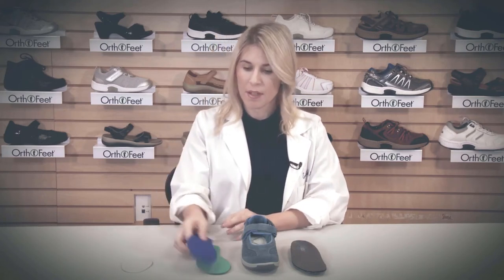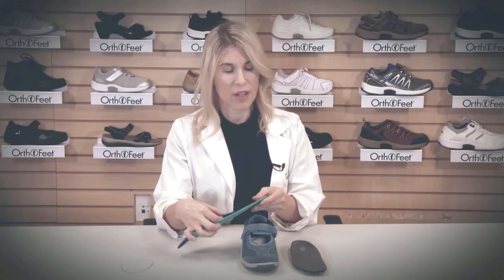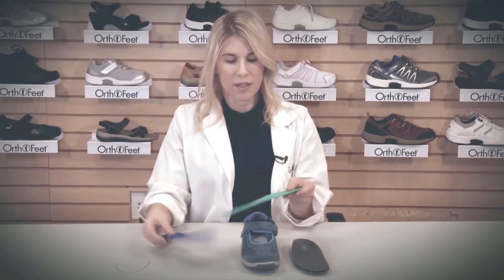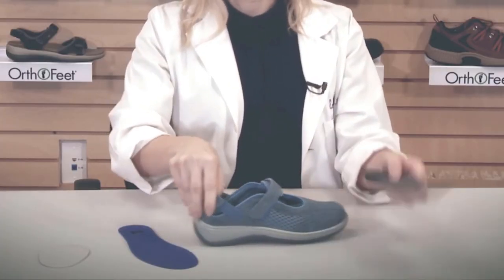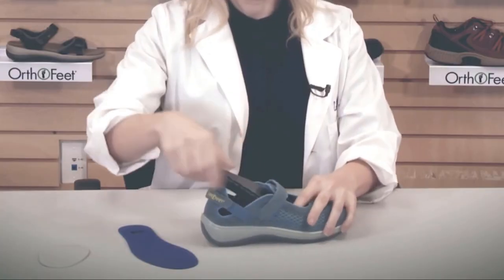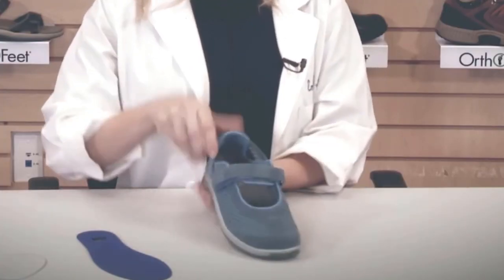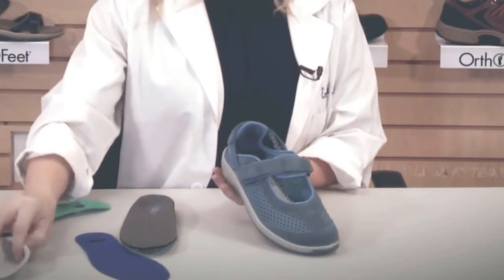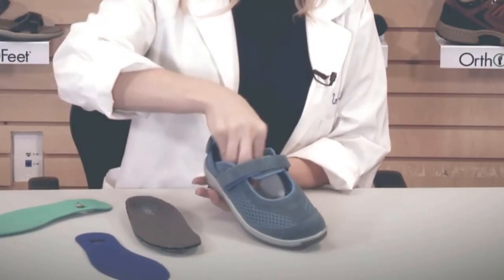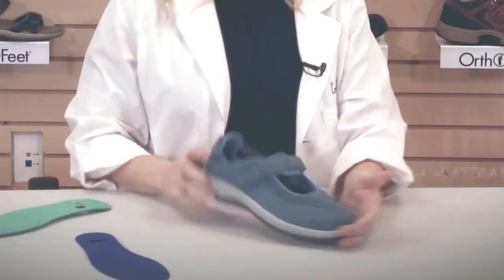Another feature of OrthoFeet shoes is that they all come with two fitting spacers. The fitting spacers allow you to fine-tune for that perfect fit. One of the fitting spacers is 1/16th of an inch, and the other one is 1/8th of an inch. To place the fitting spacer, you'll take out the insole, place the fitting spacer inside the shoe, and then add the insole on top of the fitting spacer to find that perfect fit. Another option is the forefoot pad, which goes to the front of the shoe, and you again place the insole directly on top of the forefoot pad to find that perfect fit.